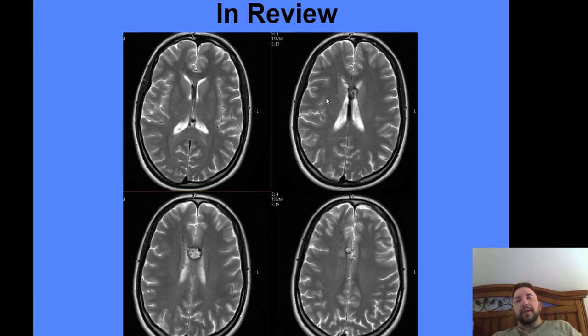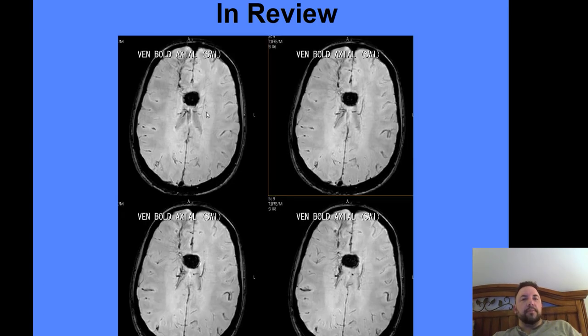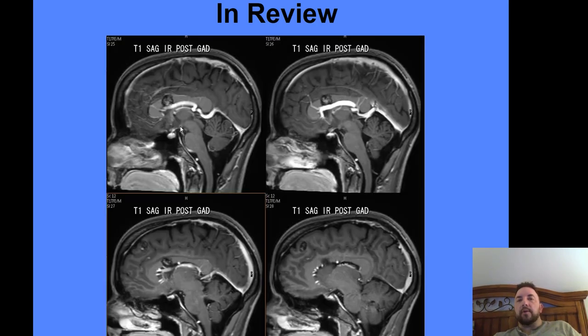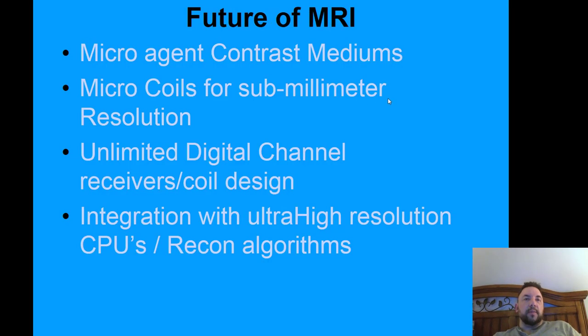So what pathology are we looking at? As you see here, multiple densities. Does this look familiar to you at all? Susceptibility artifact, that's pretty significant. Think all the way back to week 1. Cavernous hemangioma. Multiple densities within the same tissue component types can have some enhancement property to it. Cavernous hemangioma, a raspberry-like appearance, sometimes can have some venous drainage to it. Pathology that occurs on MR.